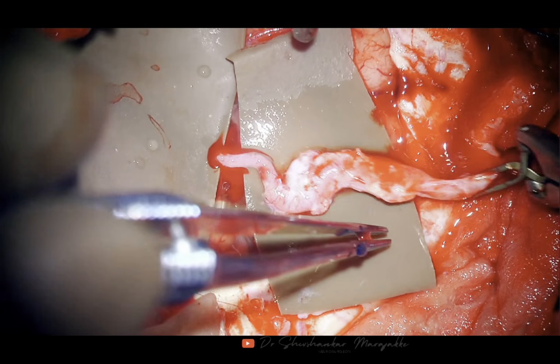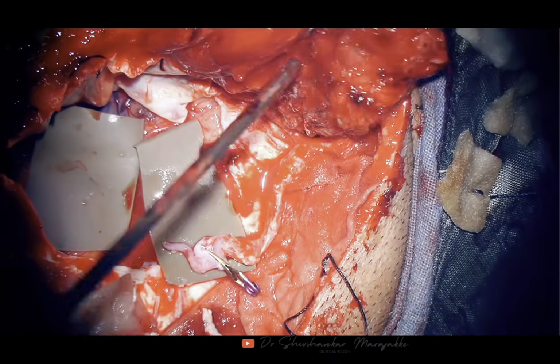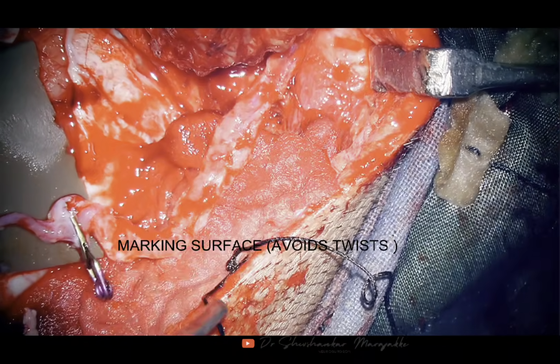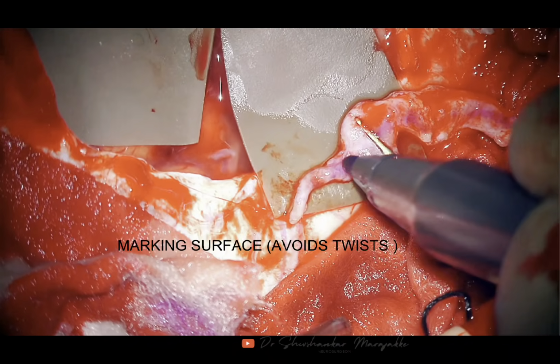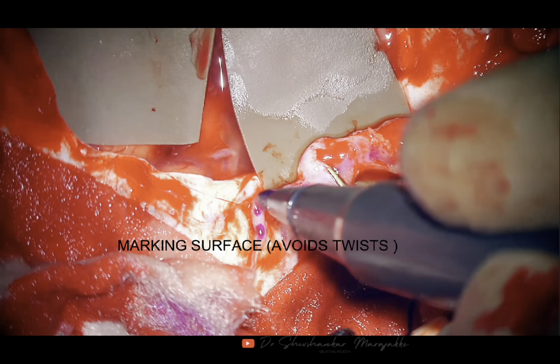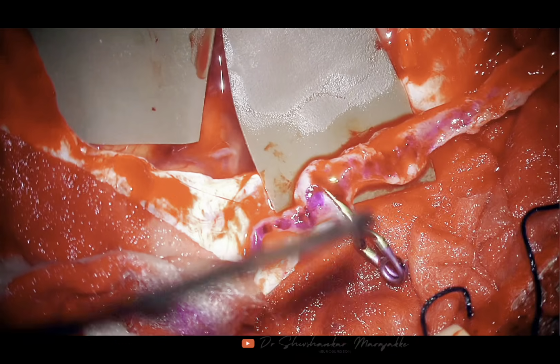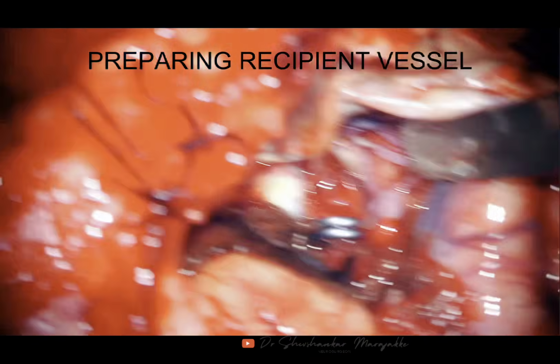So I'll recheck again so that there is no thrombus in the lumen distal to the clip applied. I'm okay with that, and I also see that the vessel is not kinked by the muscle there. So I'm marking the surface so that the vessel does not get kinked once it is anastomosed. The surface marking is quite important, and I have marked the surface with ink here. Now I have to divide the vessel.